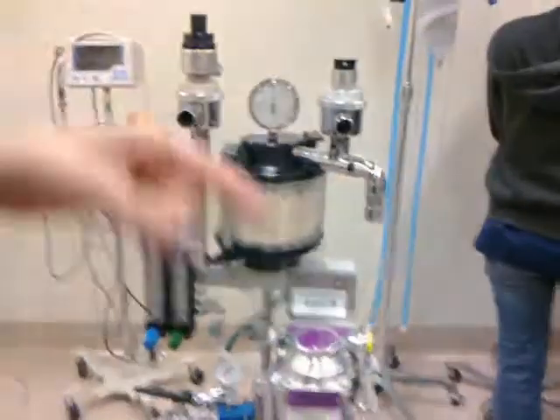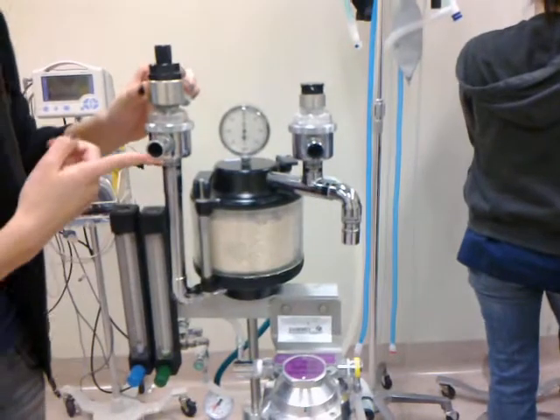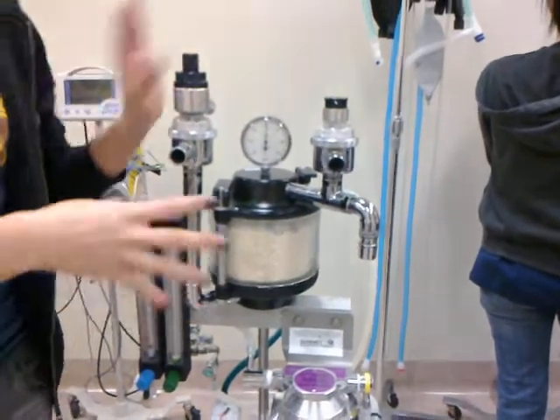This machine is missing a lot of components, so we're going to reattach them as if everything was taken apart.